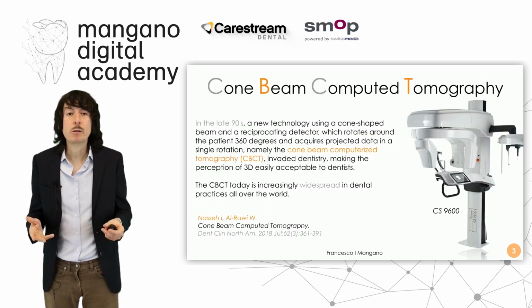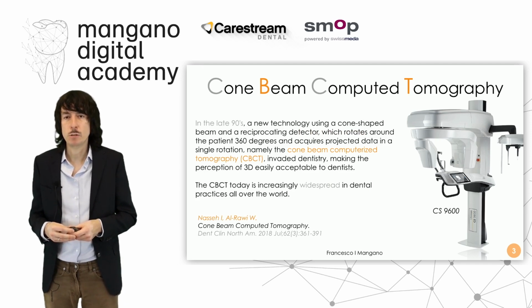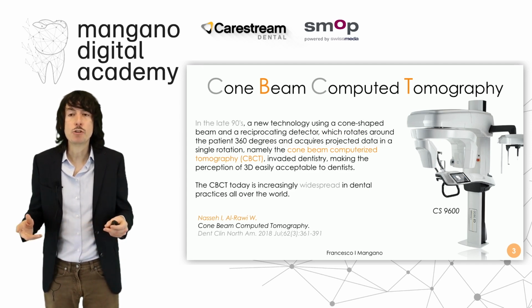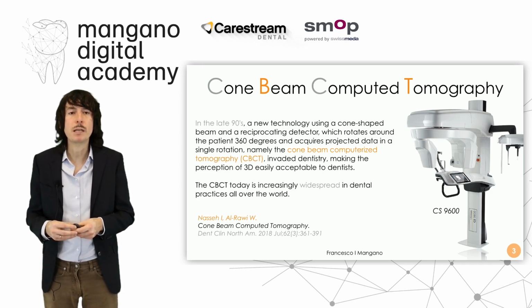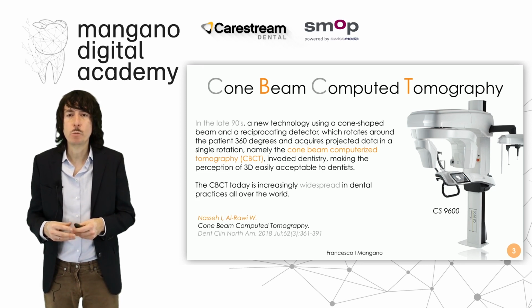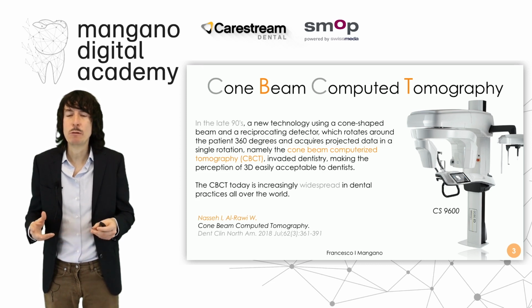When we talk about cone beam computed tomography, we are talking, of course, about the scan phase, so the first phase of the workflow, and we talk about really a game changer, because this machine appeared in the late 90s and changed completely the way we treat our patients, because they changed our diagnostic capability and accordingly the possibility to make very accurate treatment plans for our patients. We can see our patient in 3D, in 3 dimensions. They opened the door to the third dimension and they are game changers.